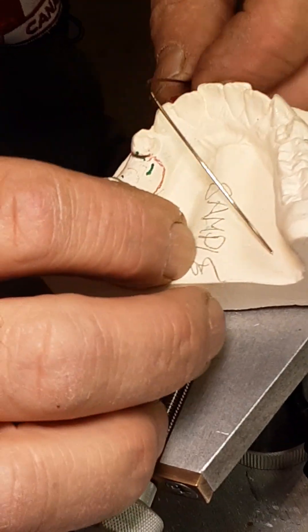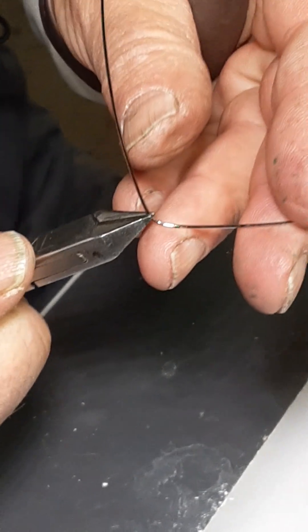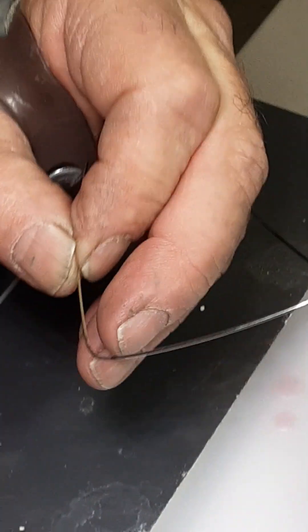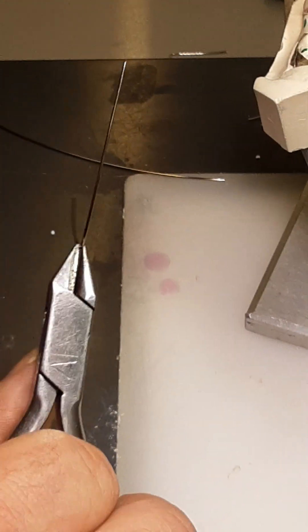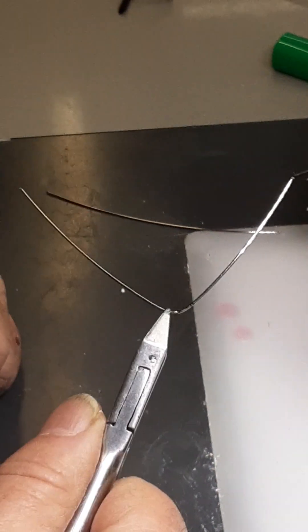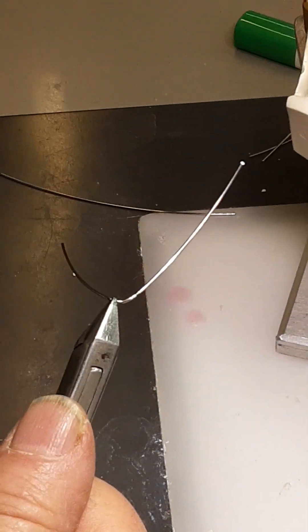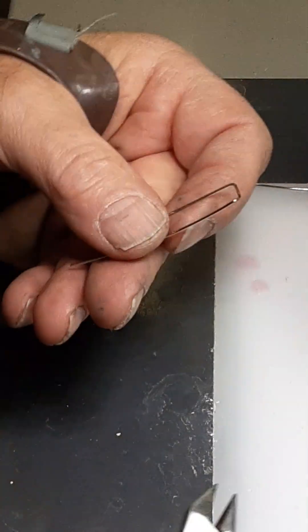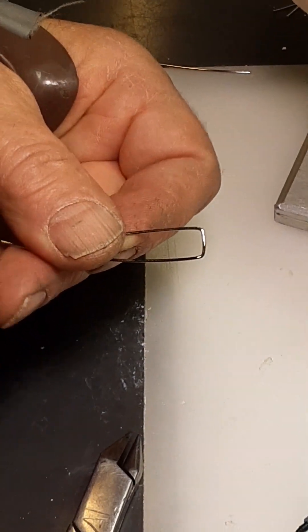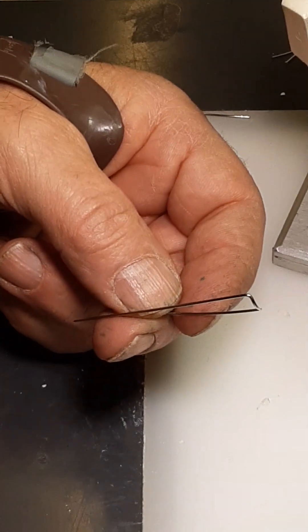I've marked the crest of the ridge. I'm going to grab the wire and hold it so that this curve is parallel to the occlusal plane, then bend it perpendicular to the occlusal plane. The wire is parallel to the plier and I'm going to bend it straight down 90 degrees. Then on the other side, grab it at my mark — straight down 90 degrees. So I now have something where this part is parallel to the occlusal plane and these wires are perpendicular to it.